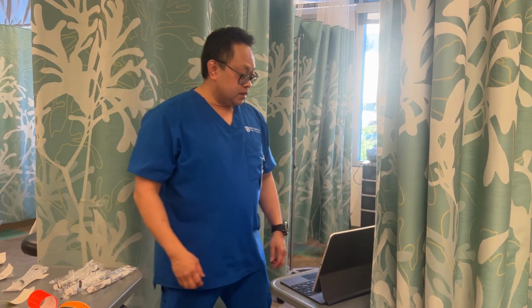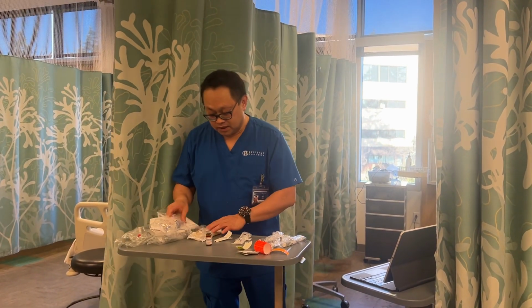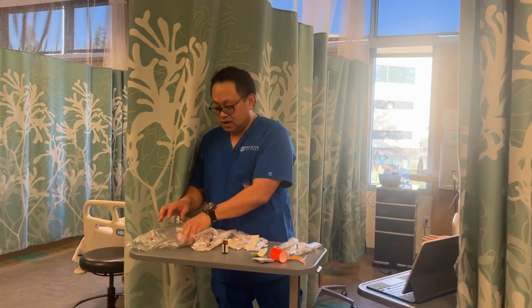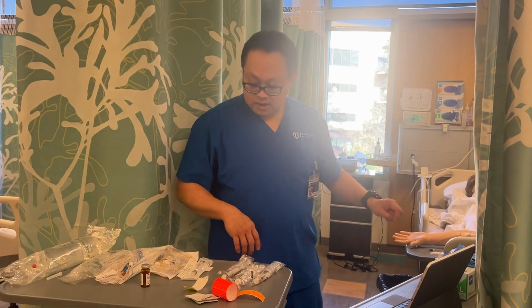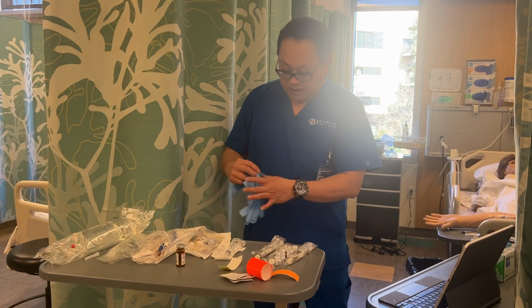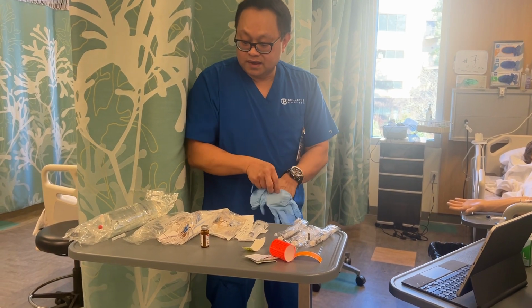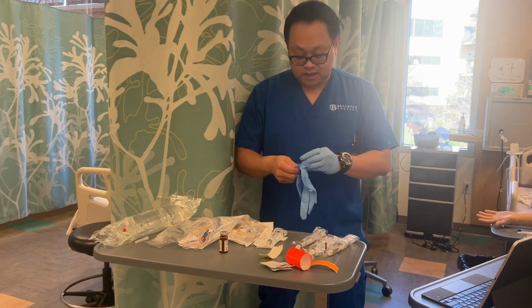Okay, so I'm going to hold my medication right now. I'm going to sanitize, hold my medication, and check my medications. I have the Zofran 4 milligrams, okay? We'll go over the calculations. I also have the ciprofloxacin, and I also have the normal saline. So I'm going to hand sanitize and put on gloves. And for each medication, I'm going to check for the color, the clarity, the consistency, expiration date, the right medication, and the right dose. All that is important for each medication, right?